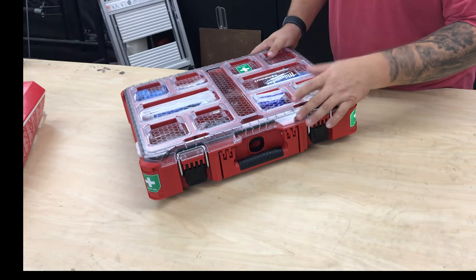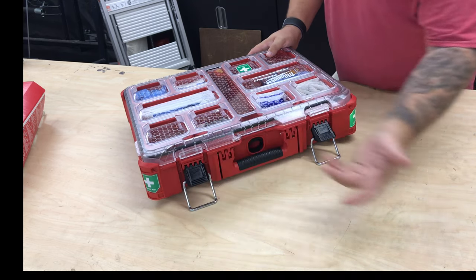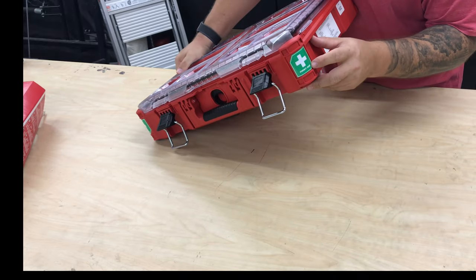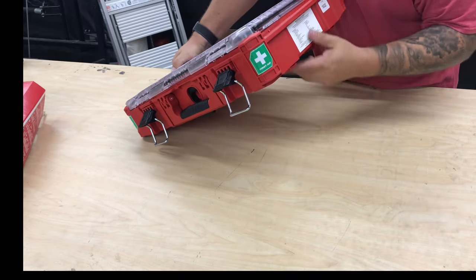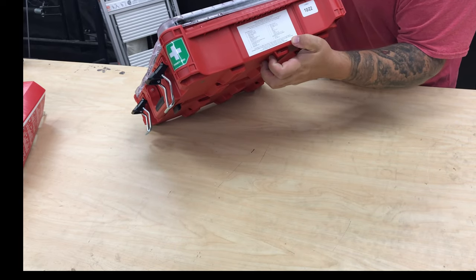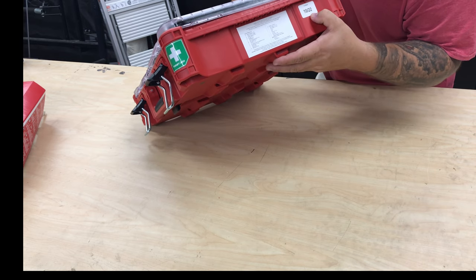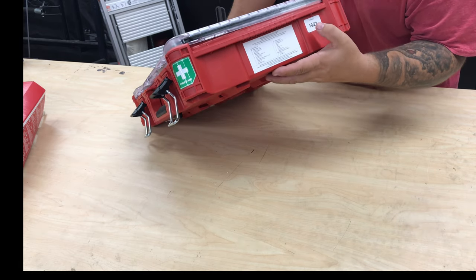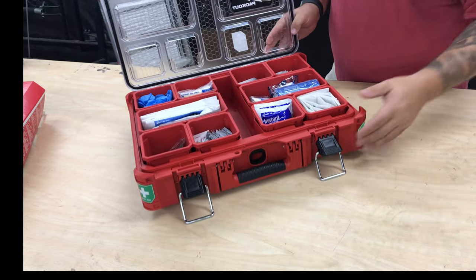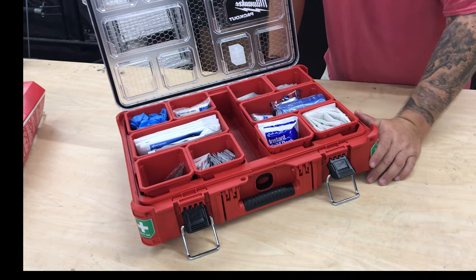Here it is. This does come in a standard Packout organizer case. What I do like is that it includes green first aid stickers on the front corners, a contents list, and an expiration date for things like the aspirin and non-aspirin that are in here. Inside are 206 pieces of first aid gear.